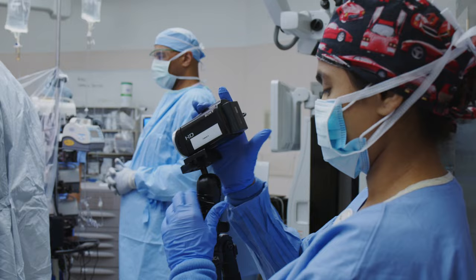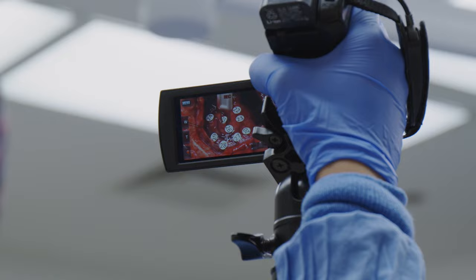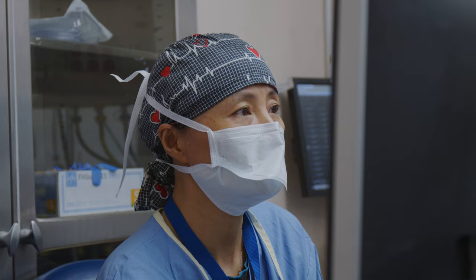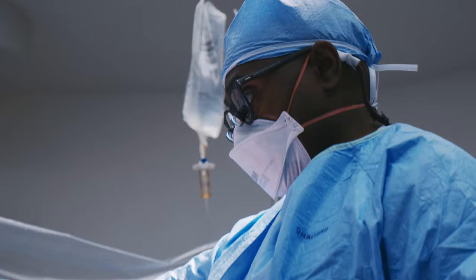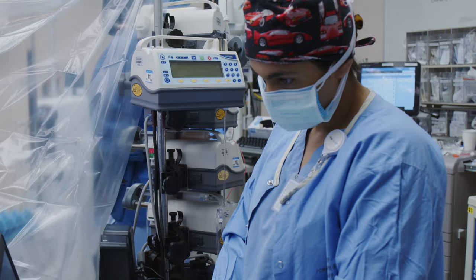Nice and loud. Each individual spot has a little tag on it, and I stimulate each spot while the patient is saying words, reading pictures, and completing sentences. As I turn on and off each little spot along the surface of the brain, we're listening for errors. If they can name the picture, that means that part can be removed. You stimulate or trial that at least three times. And that's how we map out exactly what parts of the brain are responsible for each individual function and which are not.